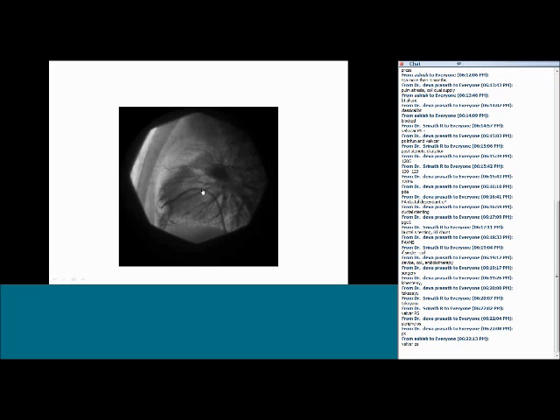See, the angio doesn't want to give you more time for diagnosis. It closes on its own. It is supravalvular pulmonary stenosis. You can see the supravalvular area is very narrow, just beyond the valve. The valve leaflets are so nice. You see, there are discrete, nice leaflets, but the supravalvular area is absolutely narrow.